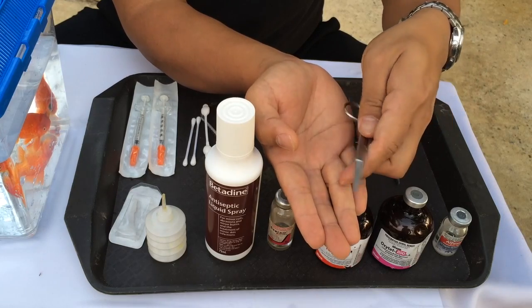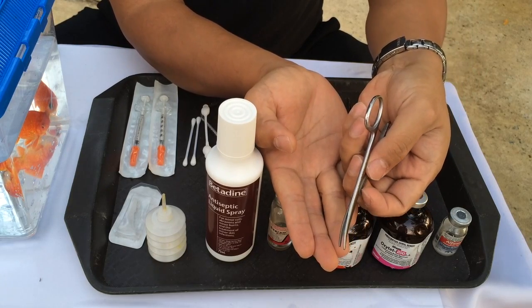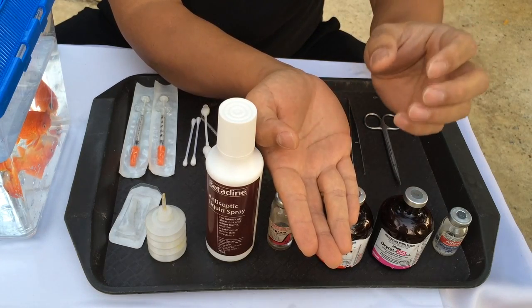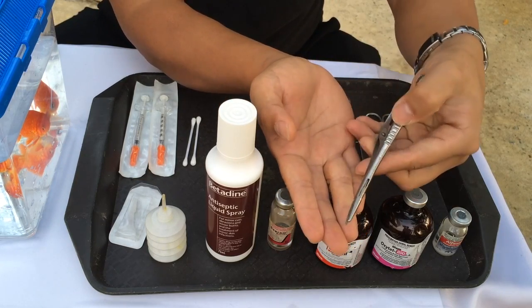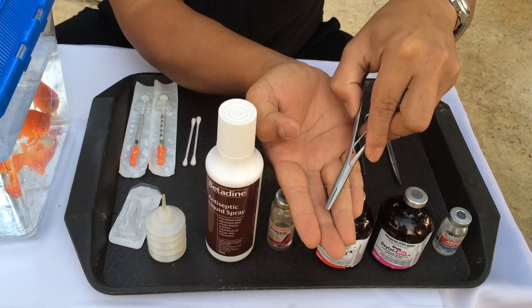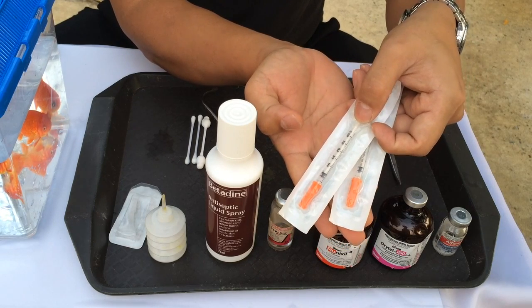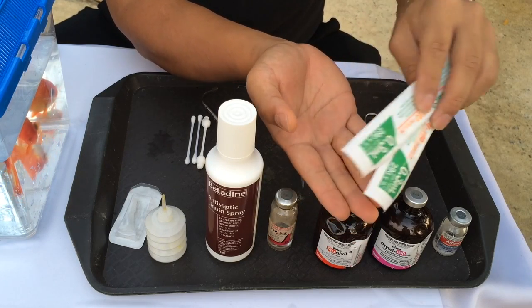We're going to use a very sharp pair of scissors to make the first incision, then proceed with blunt-ended curved scissors so you can work around under the socket without putting too much traction on the globe. The optic nerve connects to the brain, so you don't want to tug on that too hard. We also have a needle driver, which you can use to pinch large blood vessels to stop bleeding. For injections, I'm using insulin syringes — they come in 30 or 50 unit sizes with about a 29-gauge needle, suitable for small fish.